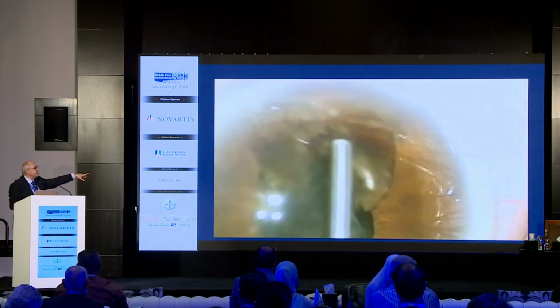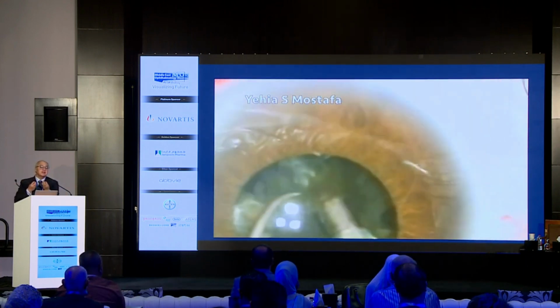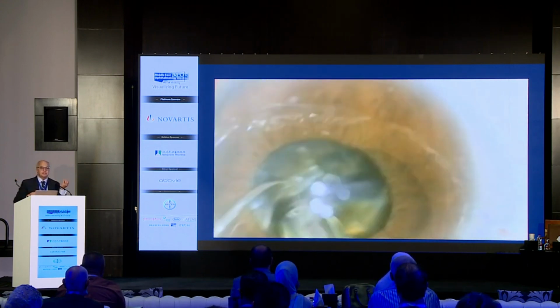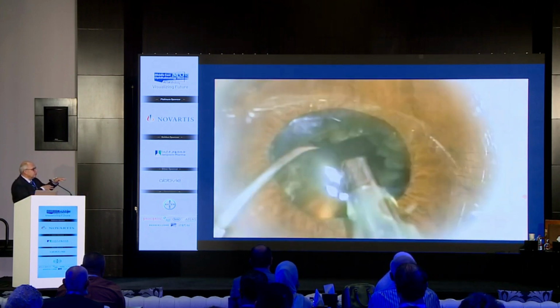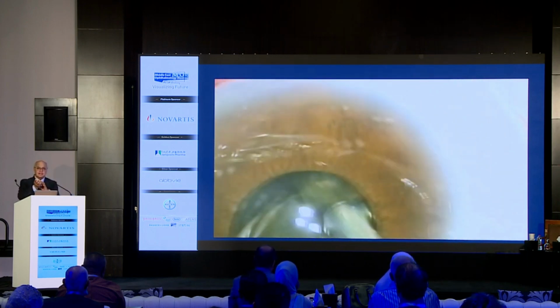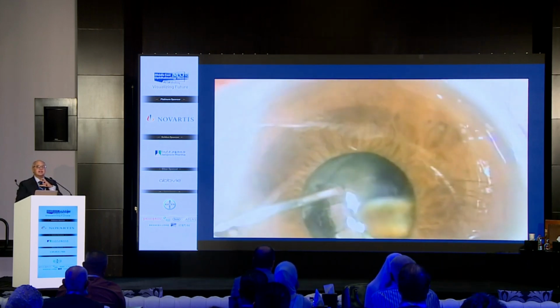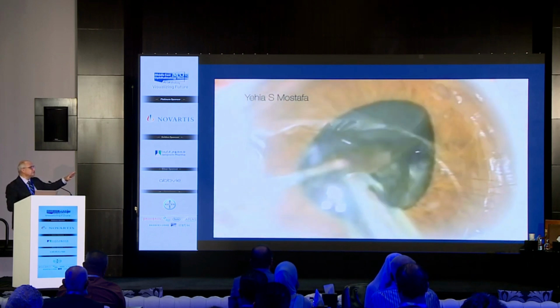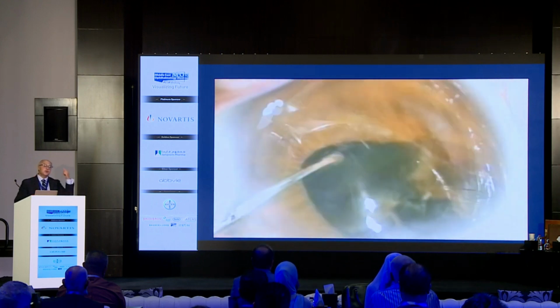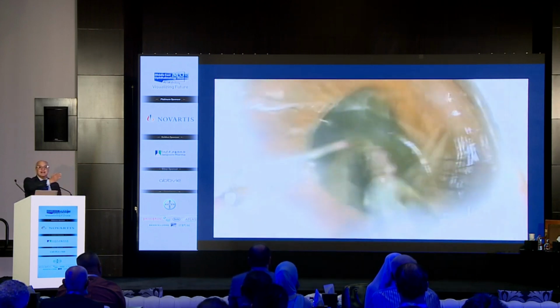And the idea always in hard cataracts, you protect the endothelium with viscoelastic, but also it is not how long you use the ultrasound, it is where you are using the ultrasound. And if you notice, I'm trying always to be behind the iris in the capsular bag, and even if at one point I get in the anterior chamber, I try to protect the cornea by embedding into the nucleus. There is no propagation. And you can judge always in such cases, even if it takes longer time than usual, you can judge your post-operative corneal appearance by seeing that the cornea is going clear all through.